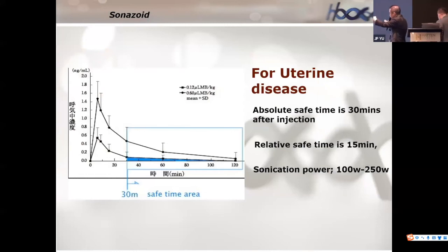Yeah, this graph. Okay. Right after injection, the concentration is high. At 30 minutes, it is lower. The skin has many air bubbles early on, but after 30 minutes, the air bubble rate in the skin is very low. But in HIFU, a small concentration of air bubbles is enough.